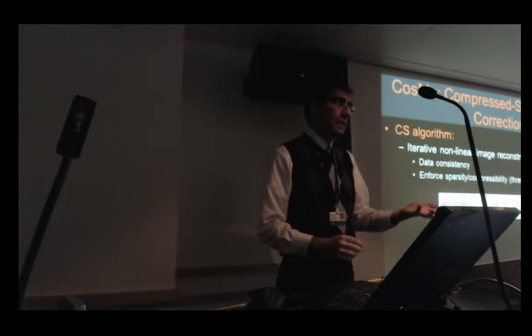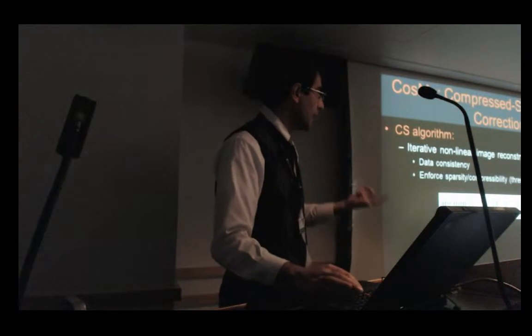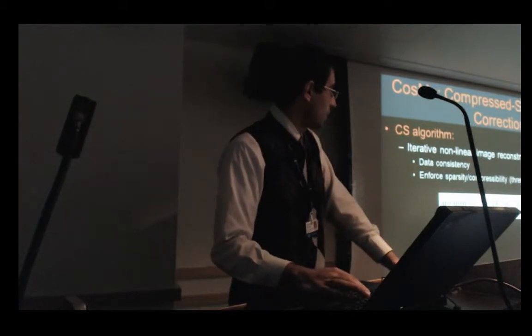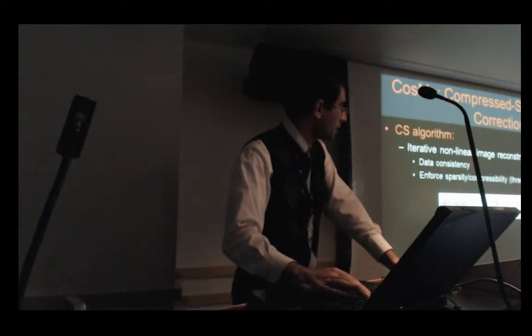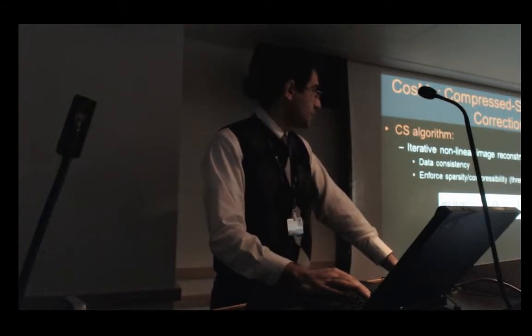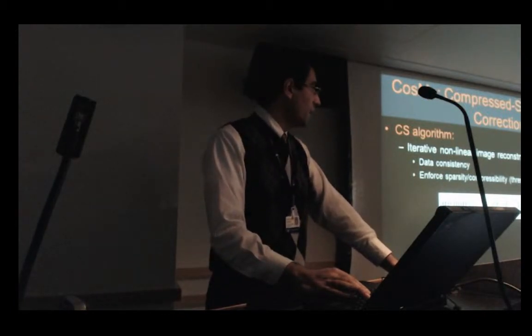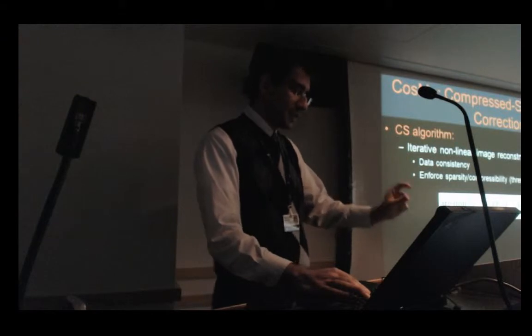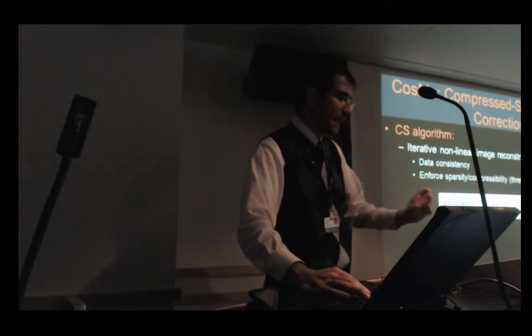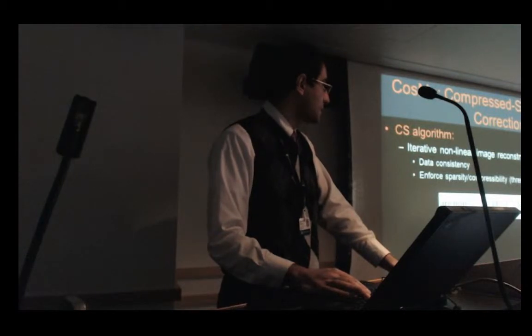Compressed sensing says let's randomly undersample the k-space data in such a way that the aliasing artifact is like a noise interference artifact. So there is no coherency in the aliasing artifact. If it is like a noise interference artifact, then I can threshold it out using L1 minimization to make the non-zero elements stand out. So basically that's the idea behind compressed sensing.